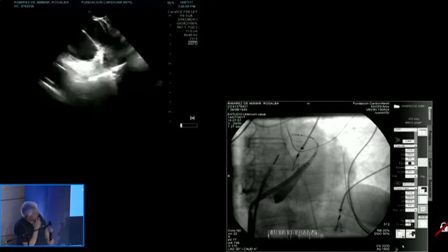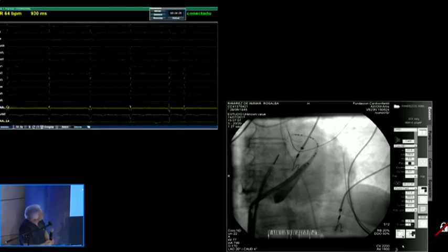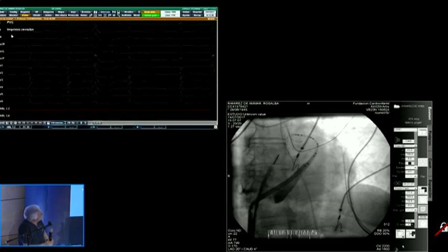First screen, the very first screen, the initial extrasystoles. These extrasystoles, these PVCs, well, this is the patient, and this is the PVC from when we started.